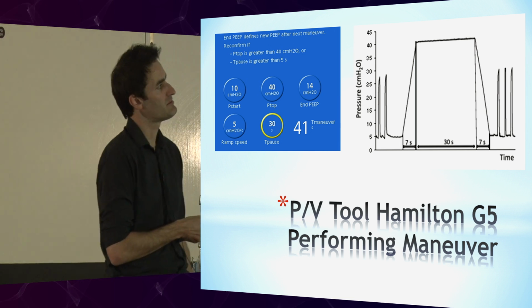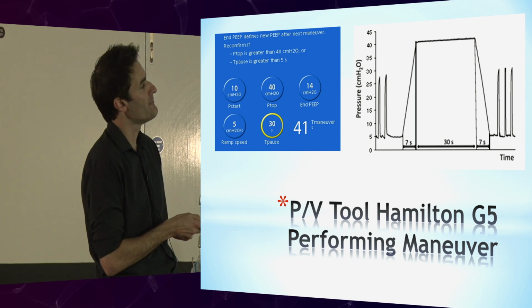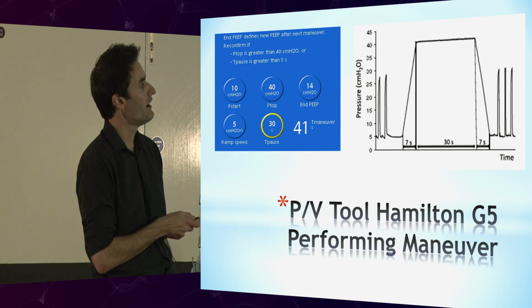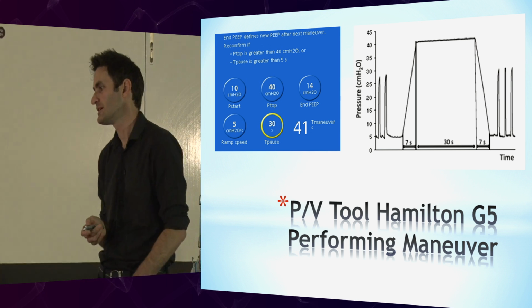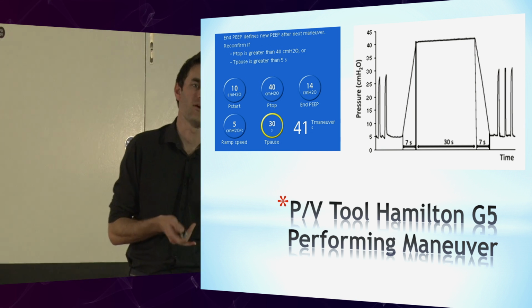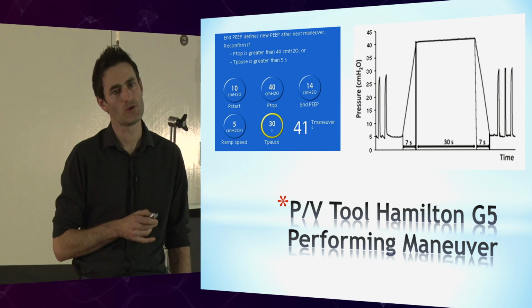You set PEEP. The PEEP beforehand that you're already on is here. Where is it? Yes, there. And then you have the ability to change the PEEP setting for afterwards. Okay. So this is the PEEP that you finish on, and that will be here. I knew you were going to ask that. So we're going to talk a bit about that in the workshops this afternoon. We could talk about this for quite a long time.